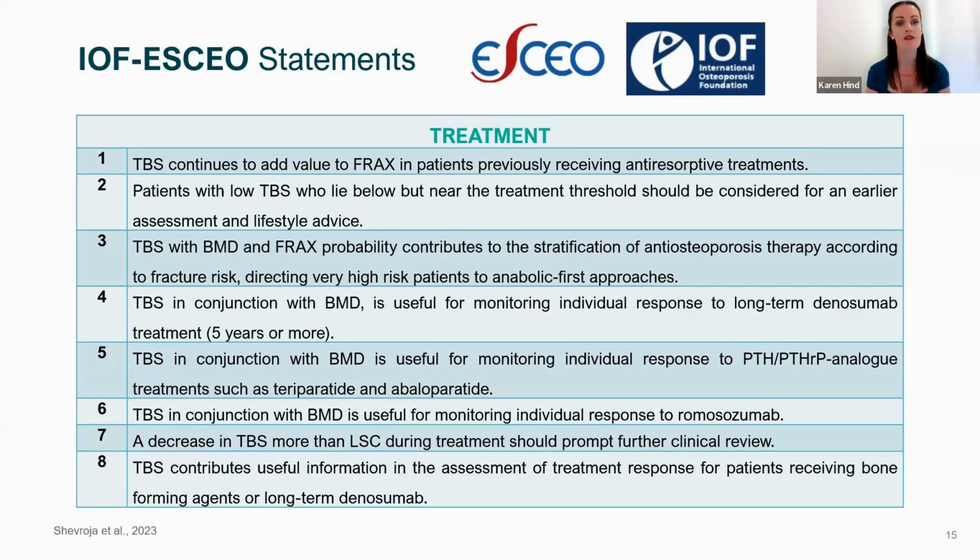TBS with BMD and FRAX probability contributes to stratifying anti-osteoporosis therapy according to fracture risk, directing those very high risk patients to the anabolic first approaches. TBS together with BMD can monitor individual response to long-term denosumab, and also for individual response to PTH and PTH analog treatments such as teriparatide and abaloparatide, and also useful for monitoring individual response to romosozumab.